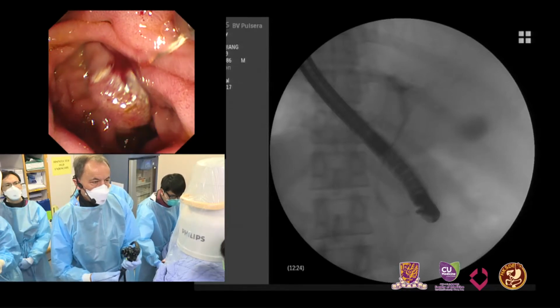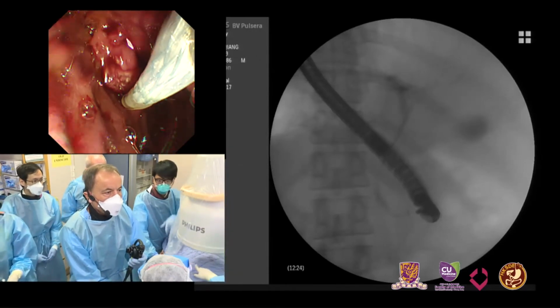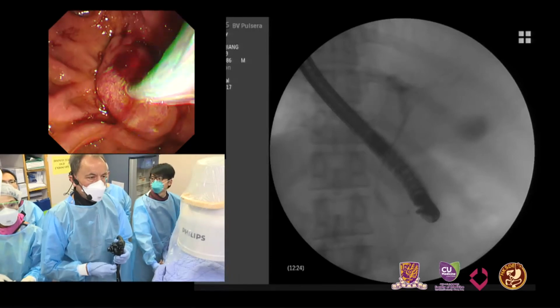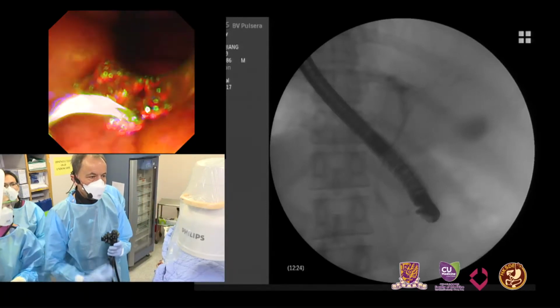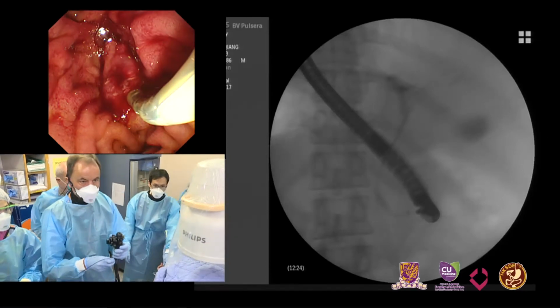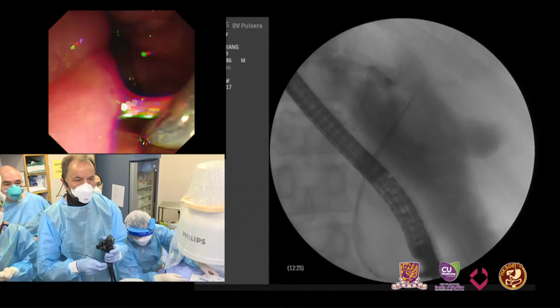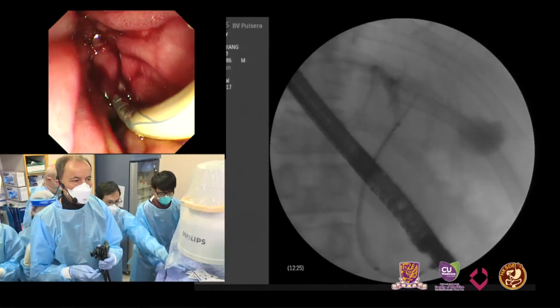Advance the stent quickly forward. The question came up. Okay. The contrast medium is almost... Pull out. I pull a little bit on the wire. So, and I insert it until I see the marker. So here's the yellow marker. We start with release. Start with release. We have to do it quickly. Go ahead. Release, release, release.